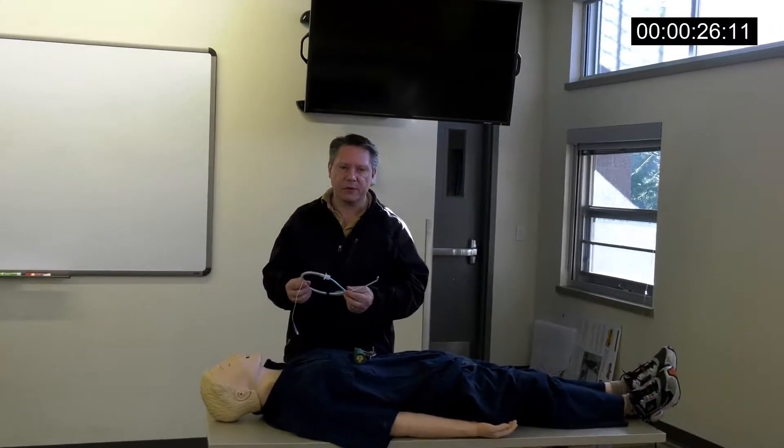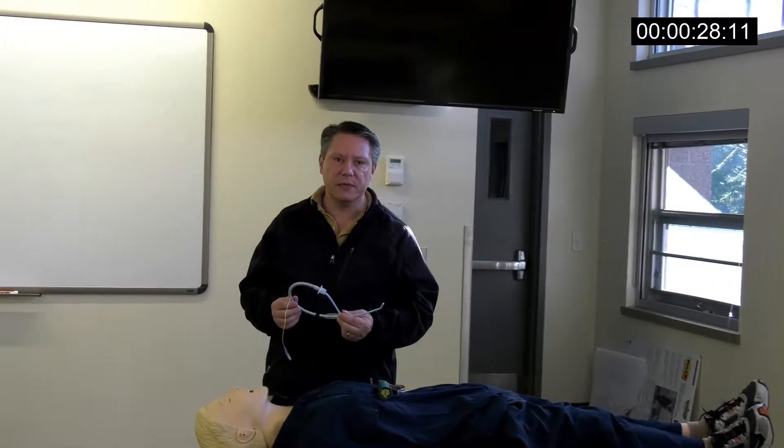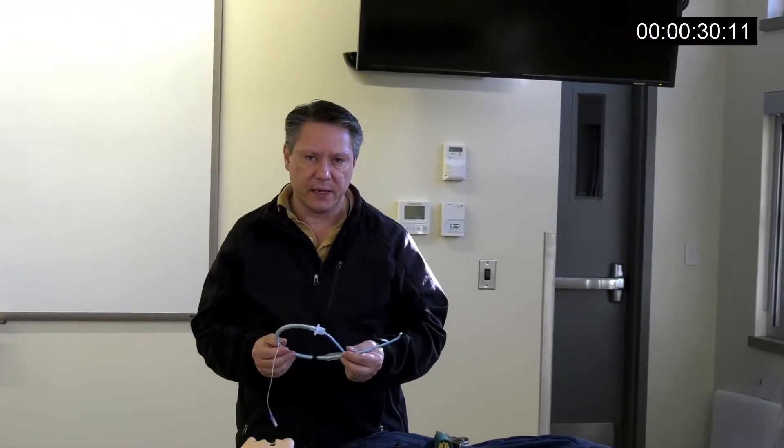In Redmond last month, there were 13 intubations. 12 of them used this technique and all had first-pass success. One guy actually intubated six times last month and said he used it every single time — he says it's the bomb.